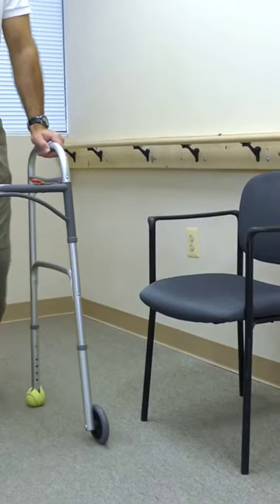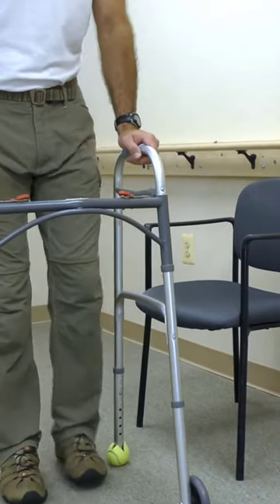In this demonstration, the left hip is the involved side that underwent total hip replacement.